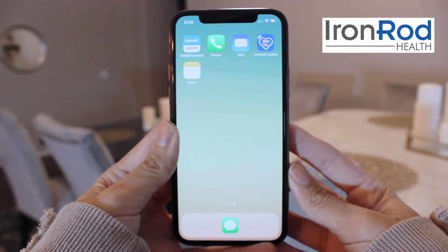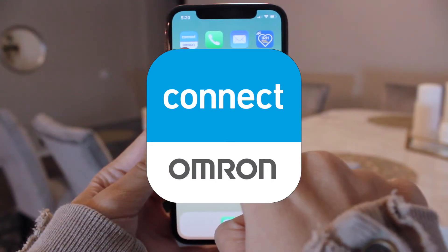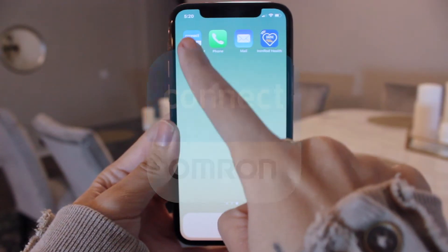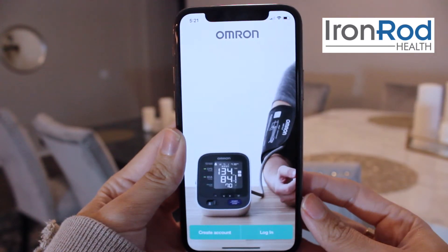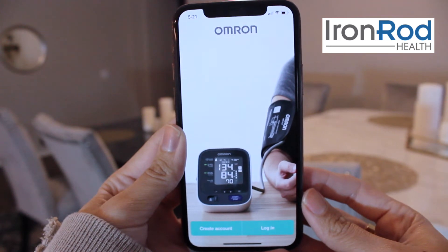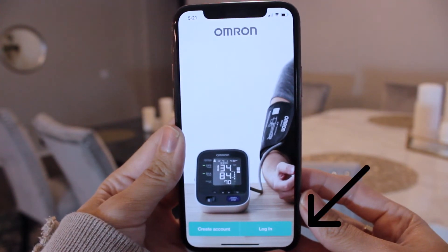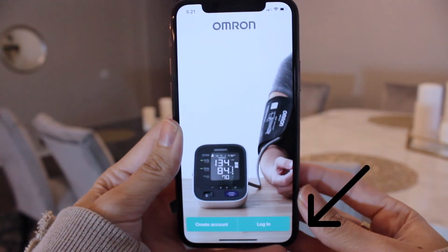First, we're going to open your Omron app. Look for the icon that looks like the one shown here. If you haven't logged into the app before, your screen should look something like this. Press the login button on the bottom right of the screen, then enter your email and password.